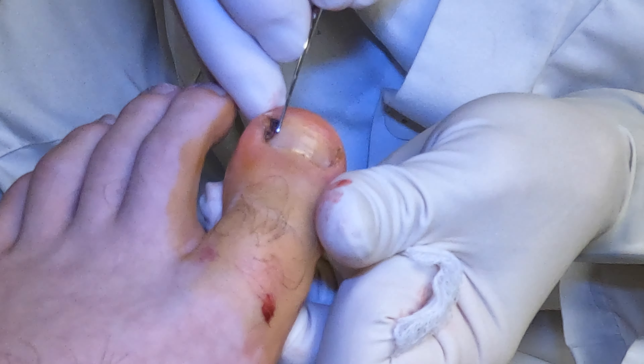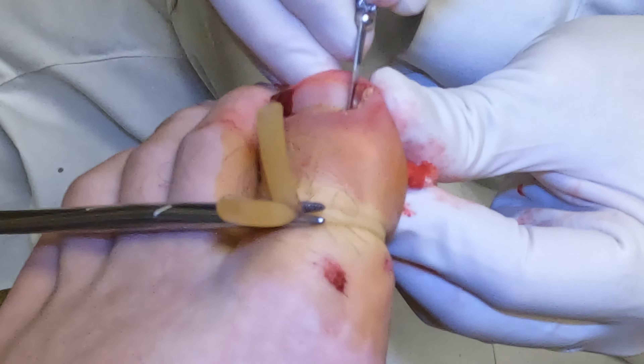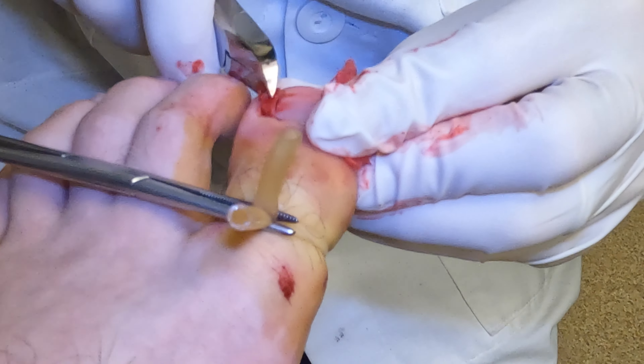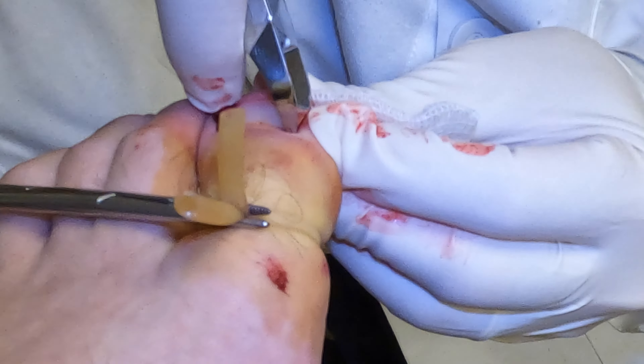Everything that we did on this left toe, we did on the right toe. Now you're asking, well, there's only two toes — how are there four ingrown toenails? Each side of the toenail was infected and we had to remove them. The right toe wasn't as bad, but we still wanted to remove these corners because he was having problems with infection before.